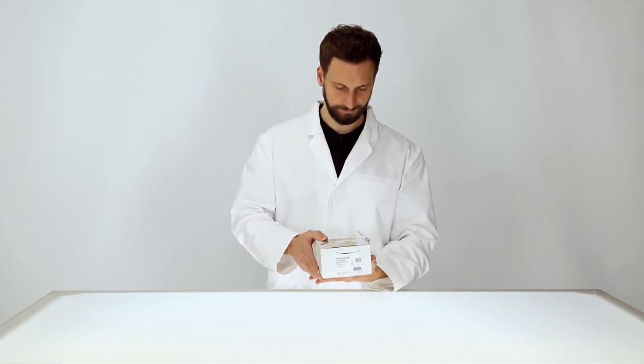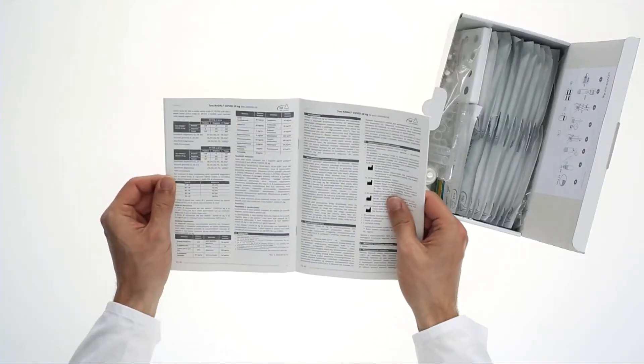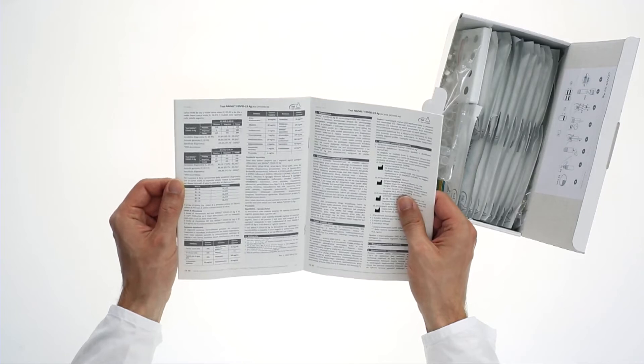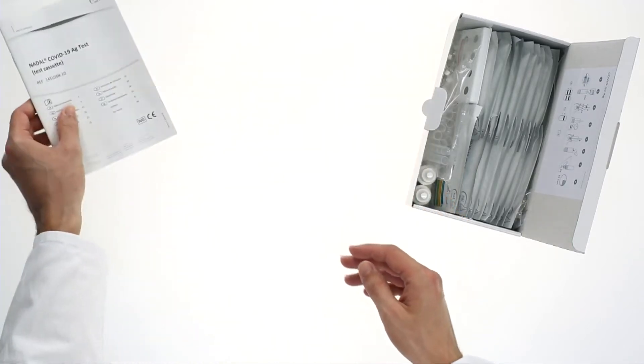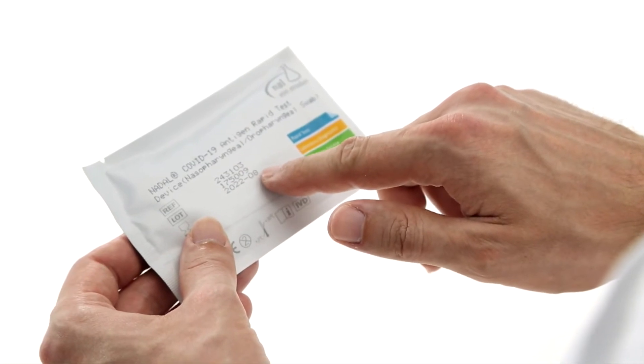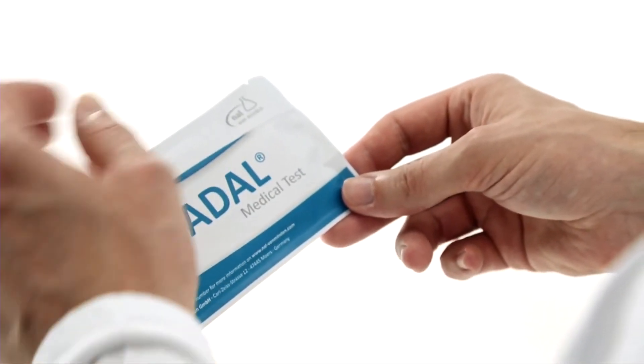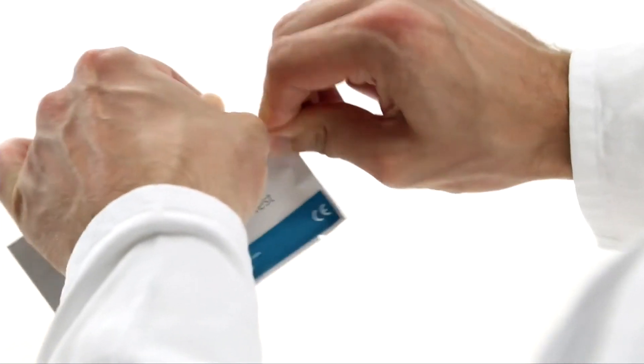All Nadal rapid tests are for professional use only. Start by reading the instructions carefully. Do not use tests with damaged pouches or beyond the stated expiry date. Use the test immediately after removing it from its pouch, and don't touch the result field.